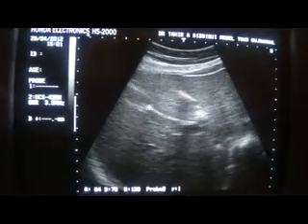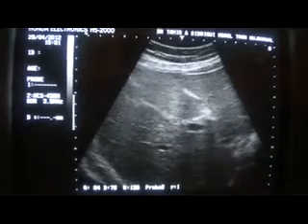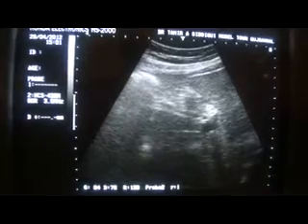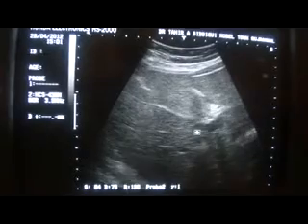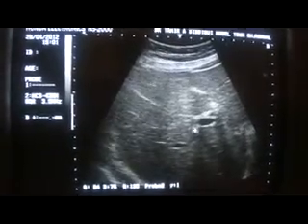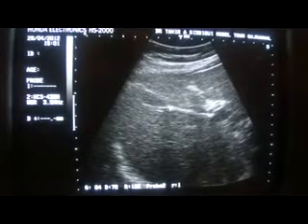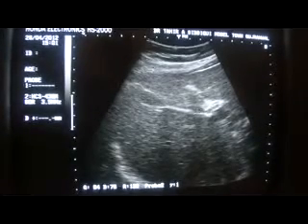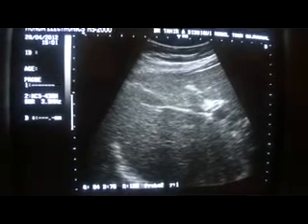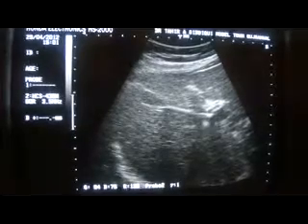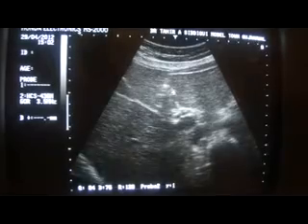Now you will see it in transverse section, and it gives posterior shadowing. Below it you can see the median lobar fissure. This is the longitudinal view of the left lobe of the liver. This is the median lobar fissure. This is the ligamentum teres — it gives posterior shadowing. The median lobar fissure will communicate with the neck of the gallbladder. This is the gallbladder, and this is the median lobar fissure, with the ligamentum teres giving posterior shadowing.